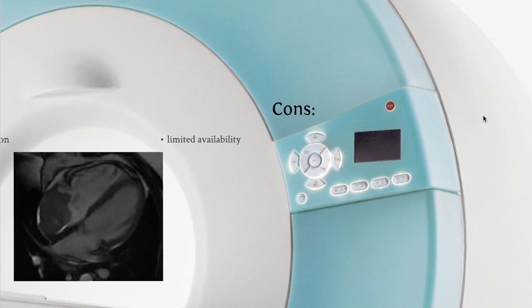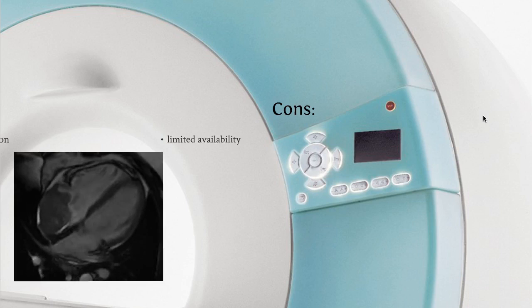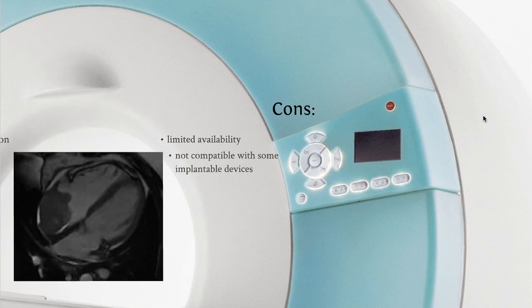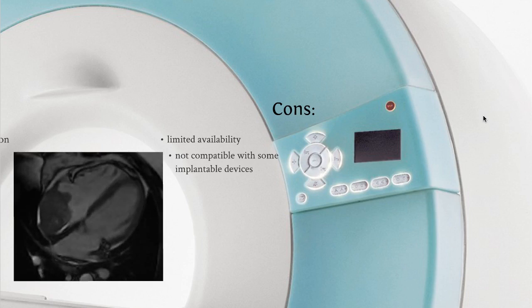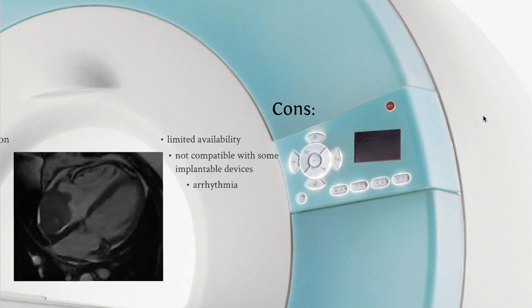There are a couple of downfalls. The availability is limited. So cardiac MRI is only really offered at tertiary care centers. We don't see this in routine hospitals throughout the country, community hospitals. It's also not compatible with some implantable devices. We have more and more devices. Even now we have an AICD that's MRI conditional, up to 3 Tesla. We scanned our first case of that 2 weeks ago.